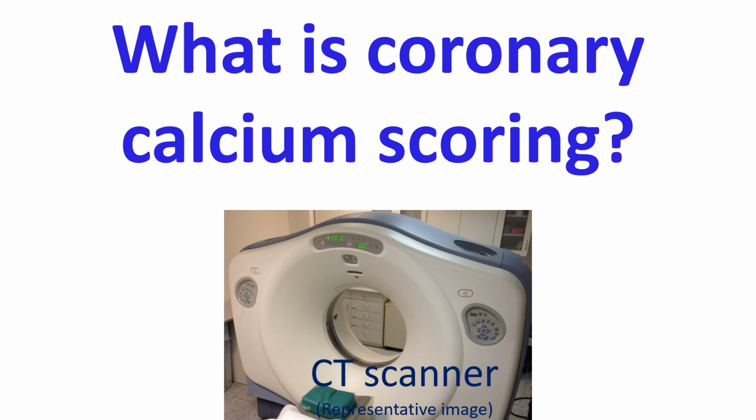Coronary calcium scoring is done from a plain multi-detector computed tomographic scan. MDCT produces images of coronary arteries in multiple thin slices. Calcium deposits in plaques within the coronary arteries can be found from these images. Calcium deposits occur within atherosclerotic lesions inside the coronary arteries. Some of these plaques can rupture later and lead to clot formation and total occlusion, causing acute myocardial infarction.